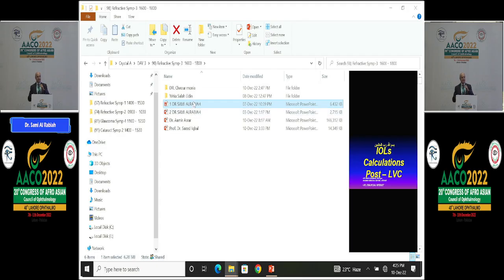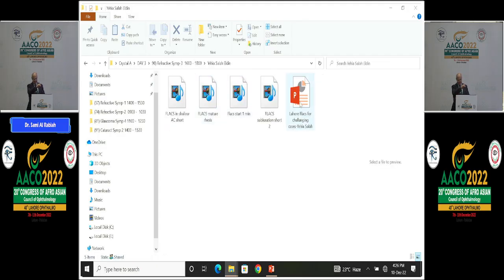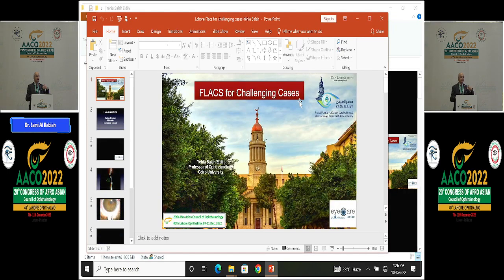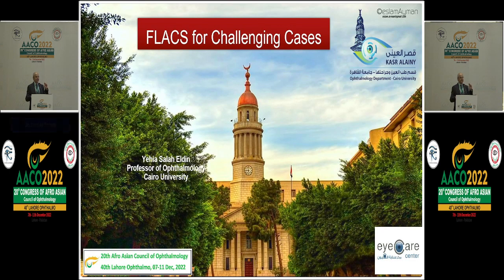Perfect. Thank you. This is my last talk in this wonderful meeting. So FLACS, or femtolaser assisted cataract surgery, I didn't used to be a great fan of. There's a lot of pressure from everybody to talk about FLACS, but I think I found some indications. One of the main indications for me is using it in treating astigmatism associated with cataract, doing intrastromal astigmatic keratotomy, 1 to 3 diopters, and for me, it's a justifiable indication.